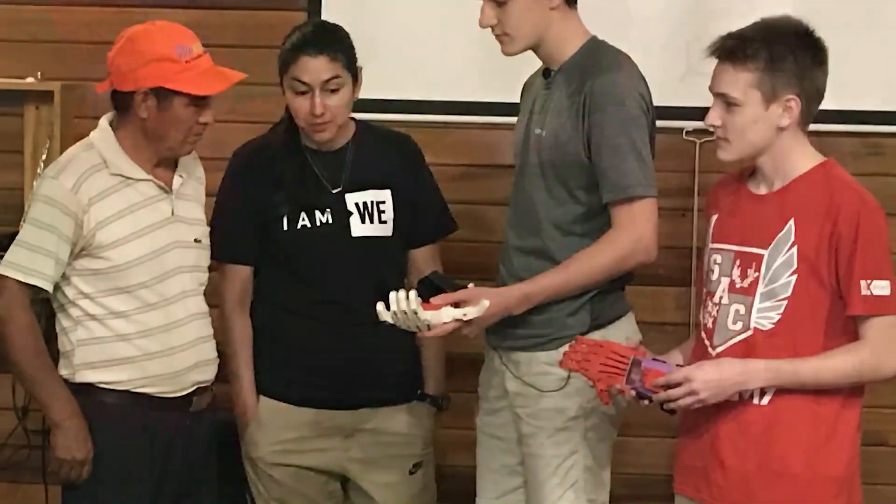After donating a 3D printed prosthetic hand to the community of Montana on last year's trip to Ecuador, we decided to expand our field of development and create a 3D prosthetic leg.